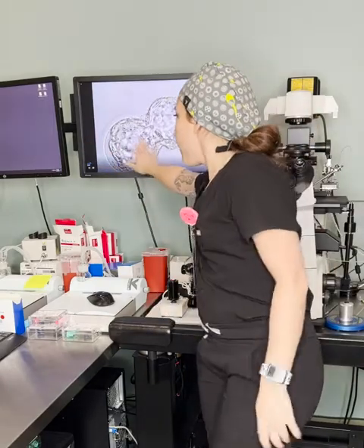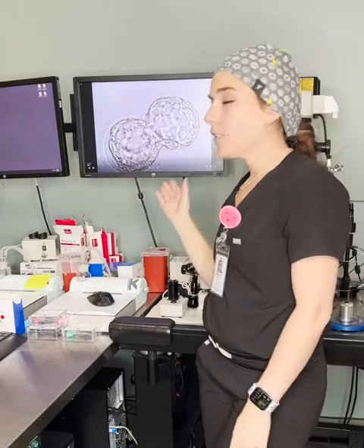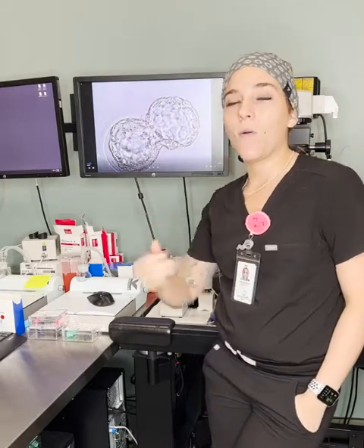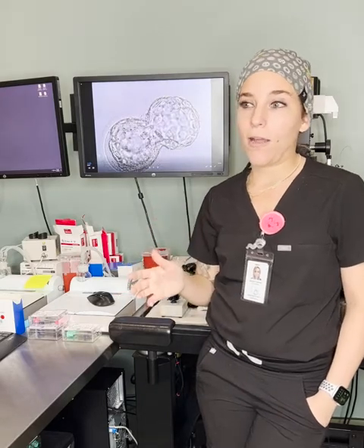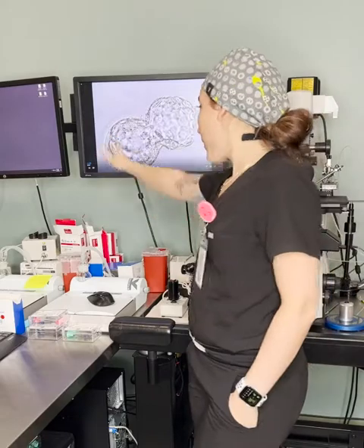So, like I said, here and here is filled with water. Think of it like a balloon, and remember these embryos are 3D. Obviously we can't see them as 3D on the screen. So what we want to do is find a junction in between two cells, hit it once with a laser that's built into this microscope, and allow that water to come out and allow the embryo to collapse so that we can freeze it with the water outside of it. Obviously it doesn't get all of the water out, it gets most of the water out. The whole concept behind this is that when we freeze this embryo and we thaw it, there will not be ice crystals inside that blastocele, causing damage or death to the cells.